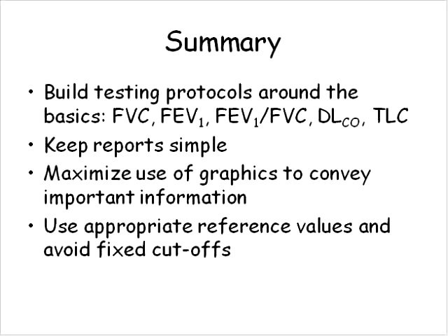And again, that's extremely important if you're going to use those lung volume compartments to then calculate total lung capacity and the residual volume. Even if you're not doing lung volume measurements, even if you're doing spirometry, it's very useful to measure the vital capacity or slow vital capacity, because as most of you are probably aware, patients who have obstructive lung disease many times will compress their airways during the forced vital capacity maneuver, and the forced vital capacity may be smaller than the slow vital capacity. We want to make sure that we look at the patient's largest vital capacity, and in many cases that may be the slow vital capacity. In Europe, the common practice is to calculate the FEV1 ratio based on the largest vital capacity that's measured, and typically that may be the slow vital capacity. And so again, that's why the algorithm says FEV1 over VC.